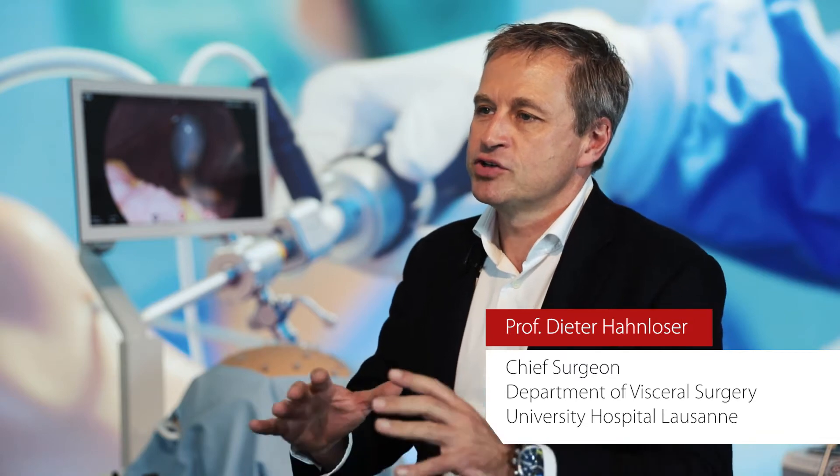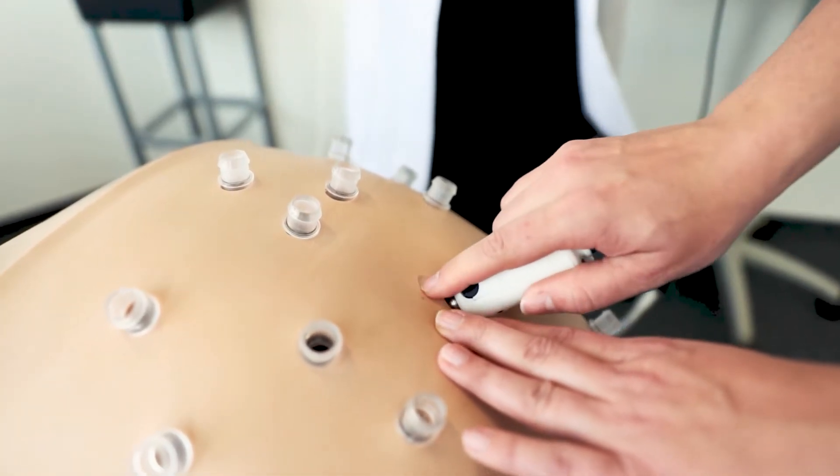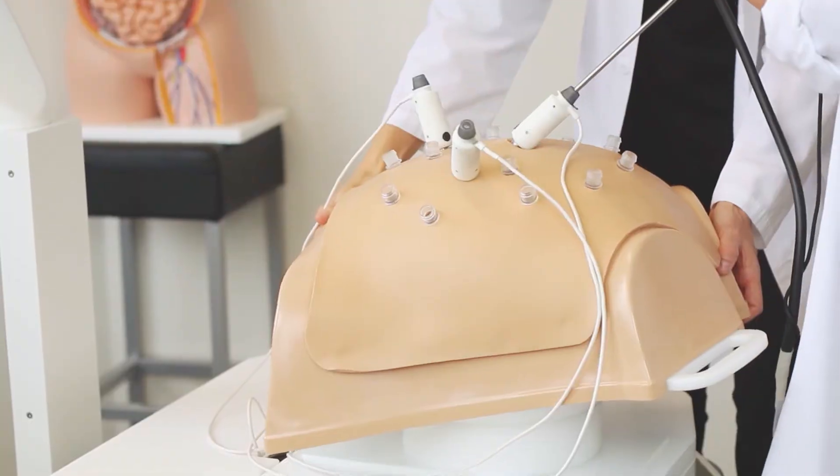What fascinates me the most with this new simulator is really taking not just the operation into consideration, but the entire preparation, positioning, trocar — and being able to simulate as close as possible to reality.